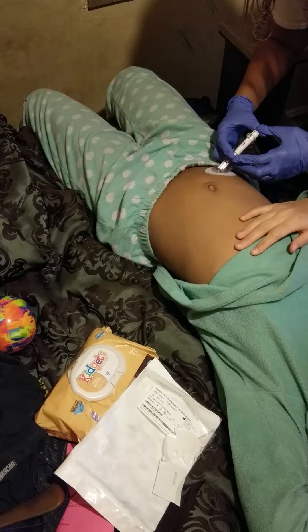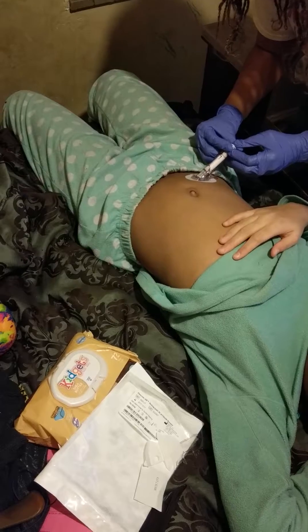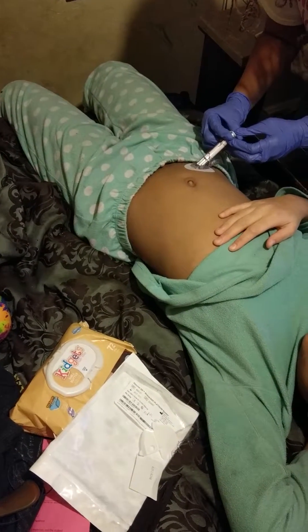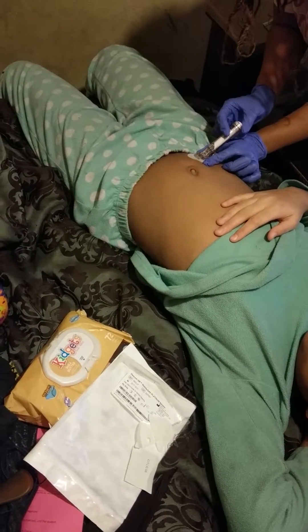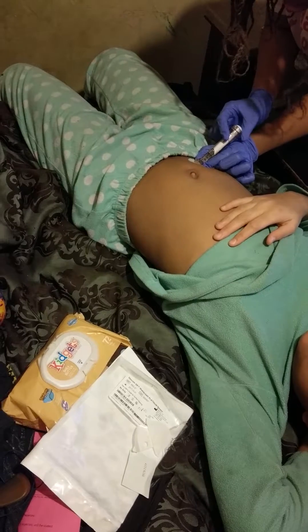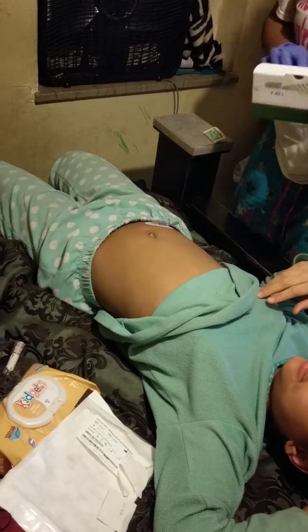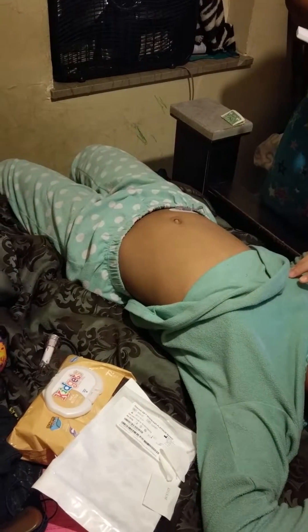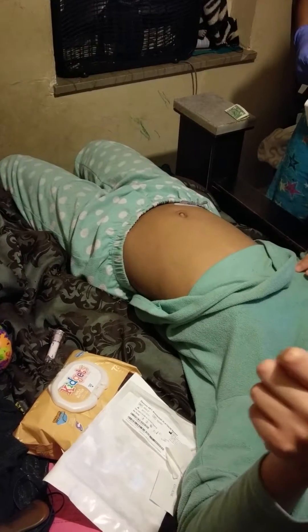Okay, are you ready? Yeah. One, two, three. Heard the clicks. One, two, three. One, two, three. So far, it's a-okay.